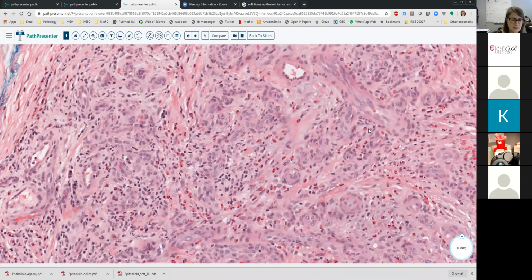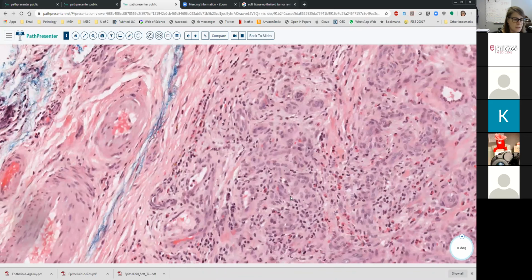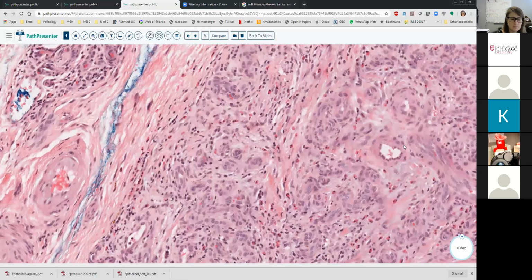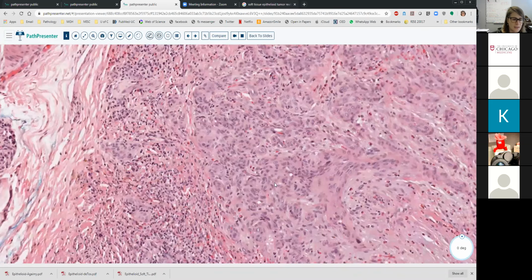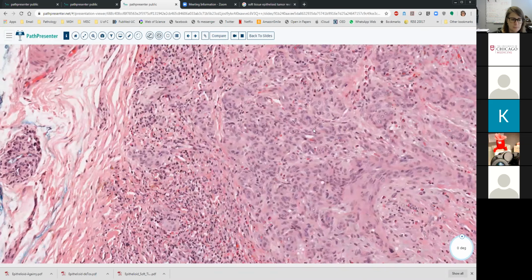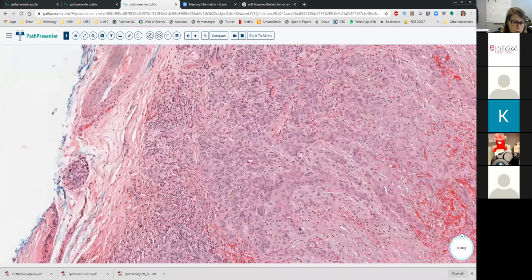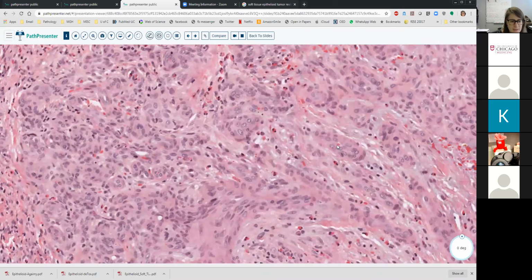What's the cell that you see a lot of in the background? A lot of lymph. Eosinophils. A lot of EOs, right? Okay. What about these cells in between the EOs? Are they trying to form structures, or are they just sheet-like nondescript? Forming small capillaries, maybe. I think they're balling up on each other. They're trying to form either little balls or maybe swoops of perhaps capillaries. Here's one that has a blood cell in the lumen.